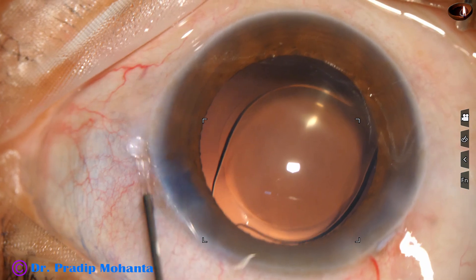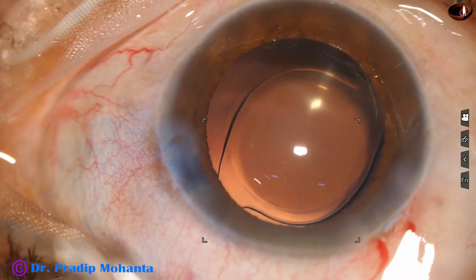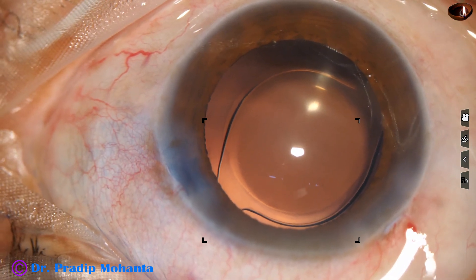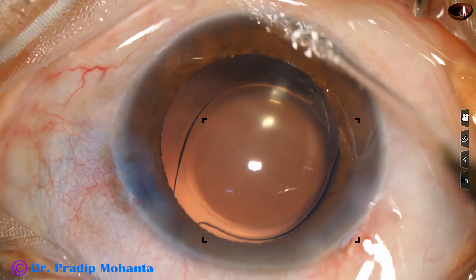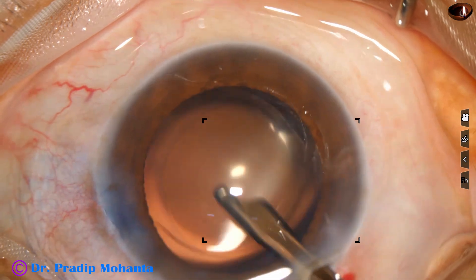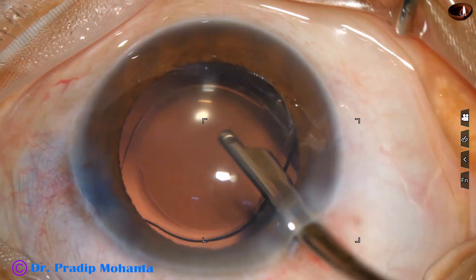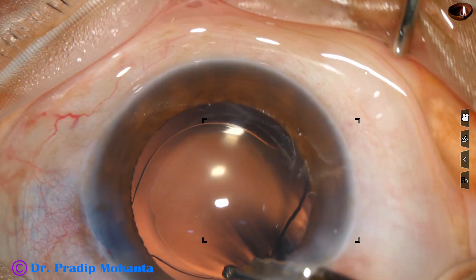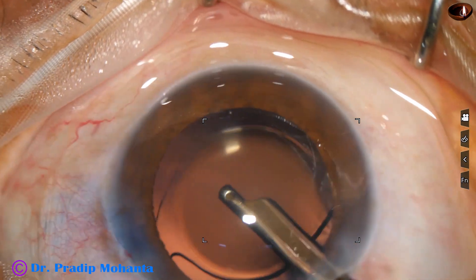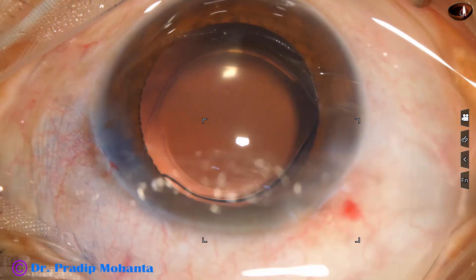And now this is a bit of moxifloxacin. The side port is closed by stromal hydration. And then final lavage of the anterior chamber is done. This is very important to have a quiet eye in the postoperative period. There should not be any particles seen in the anterior chamber — the anterior chamber should be clear. The capsular bag should be clear. Pure BSS and probably few molecules of moxifloxacin is remaining there.